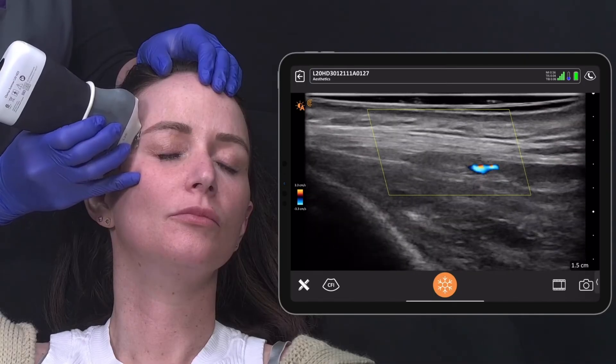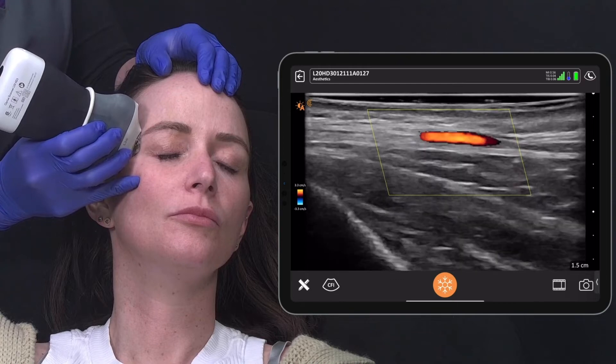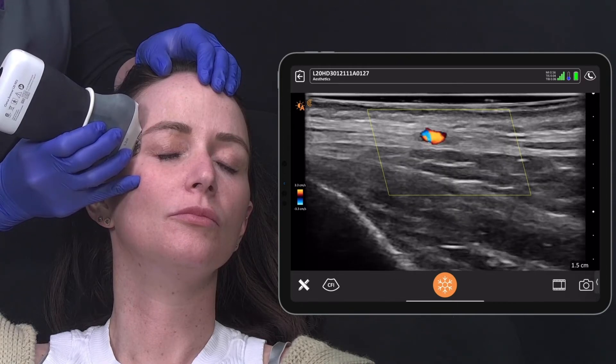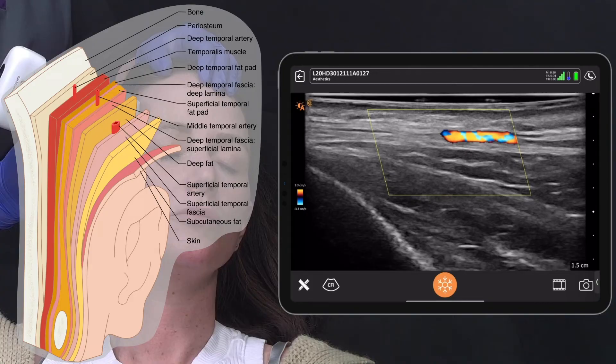Let's start. I make sure I have a finger rest so I don't apply pressure to the tissue. We can observe most of the temple layers on this scan. The first layer is the skin and then the subcutaneous fat, after which comes the superficial temporal fascia, which houses the superficial temporal artery. Beneath this is the deep fat, which is the fourth layer, and the layer into which we want to place our filler today.